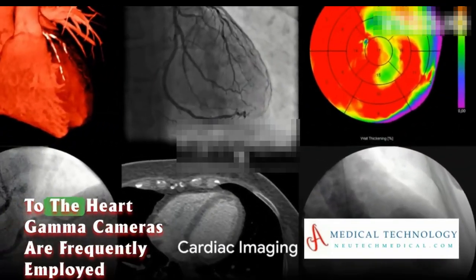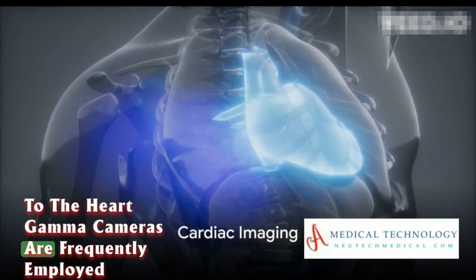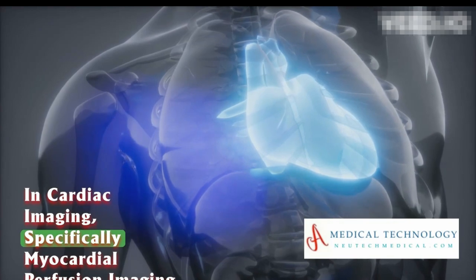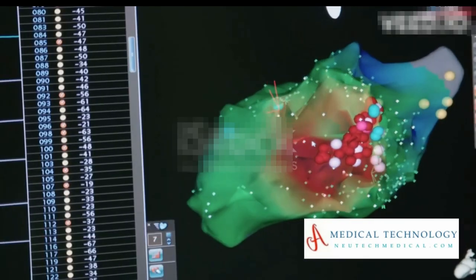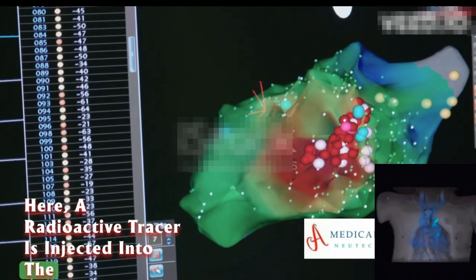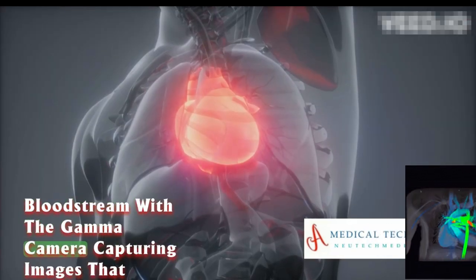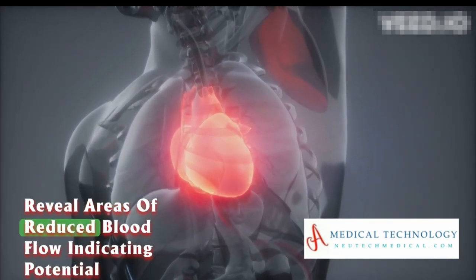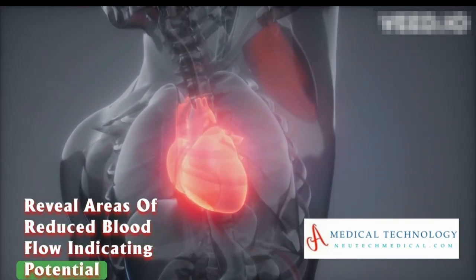Gamma cameras are frequently employed in cardiac imaging, specifically myocardial perfusion imaging. A radioactive tracer is injected into the bloodstream, with the gamma camera capturing images that reveal areas of reduced blood flow, indicating potential issues such as ischemia or infarction.